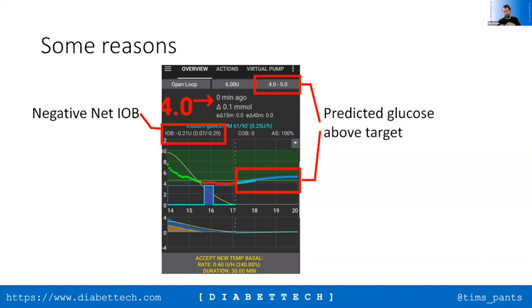So essentially, if you're using a bolus calculator on an insulin pump, if your range was set to 4 to 7, you were at 9, and you were doing a mealtime bolus, what it would then do is give you insulin to correct for that range, and then give you insulin for the carbs as well, based on the IC ratio.